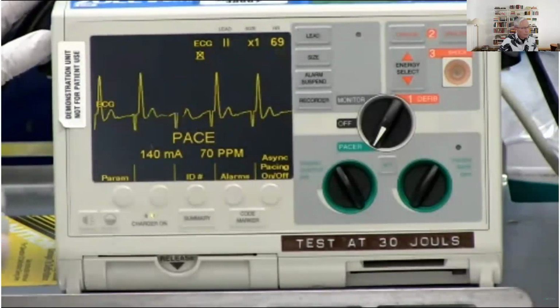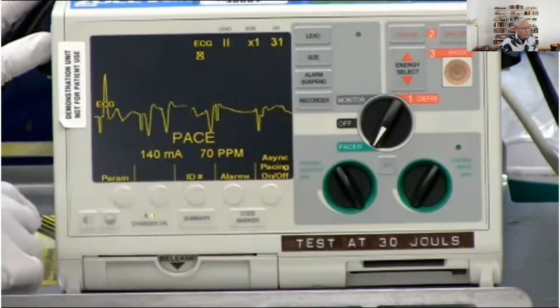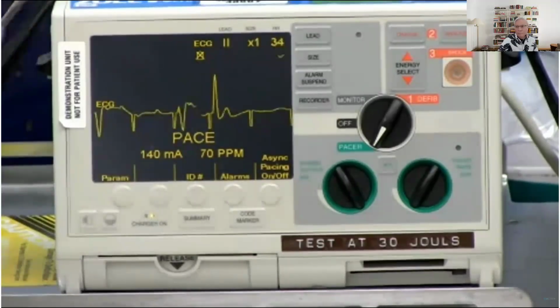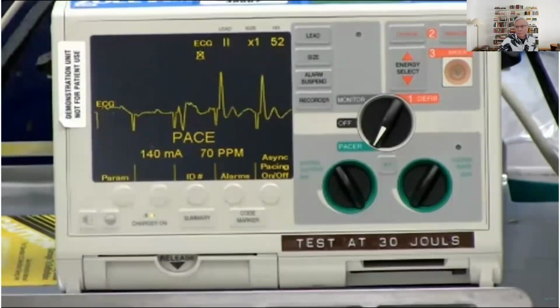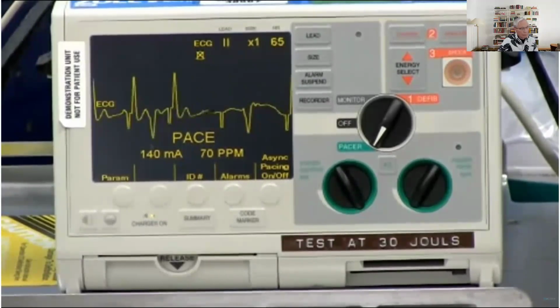The presence of a wide QRS complex after each pacing stimulus suggests but does not confirm the capture. Cardiac capture should be confirmed by assessing the pulse, blood pressure, and clinical status of the patient.